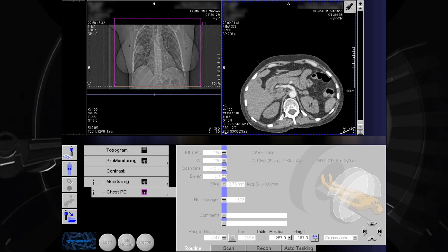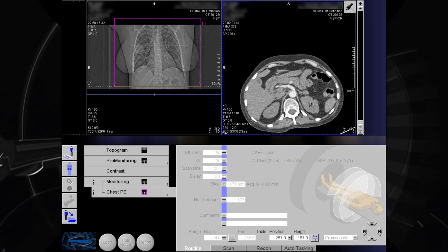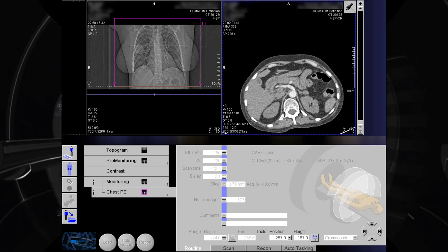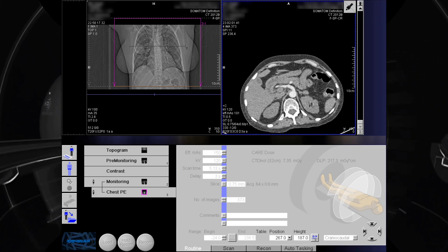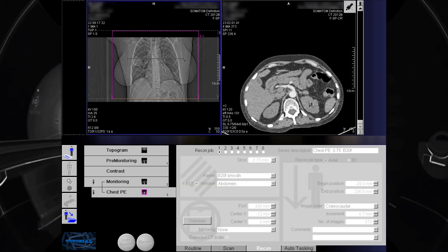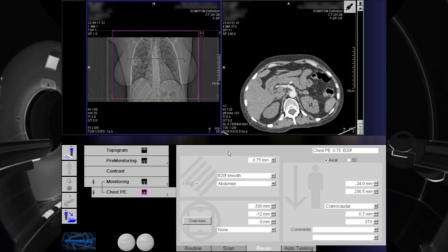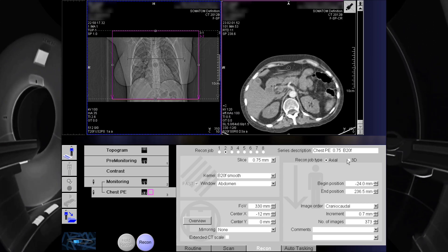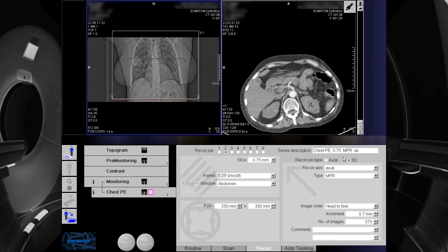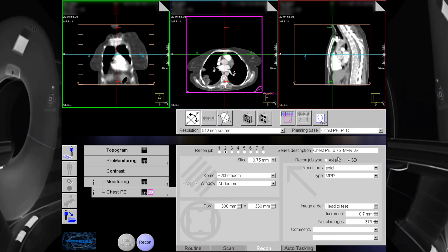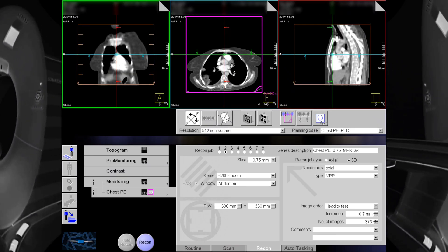Acquisition done. Now, we are going to reconstruct our images.